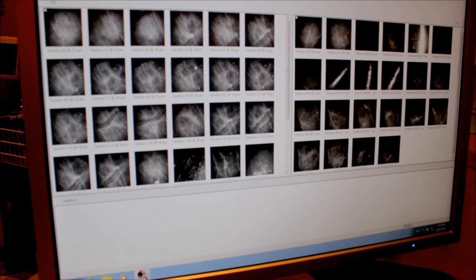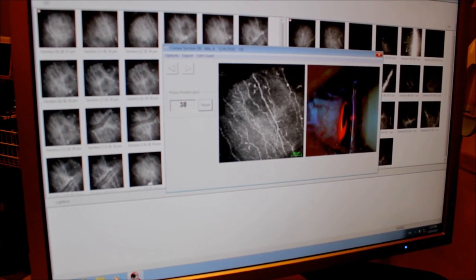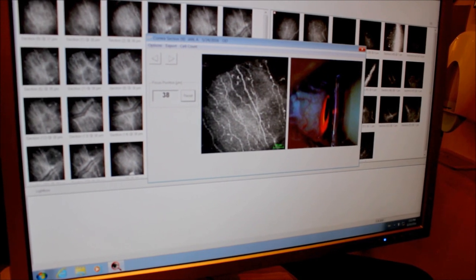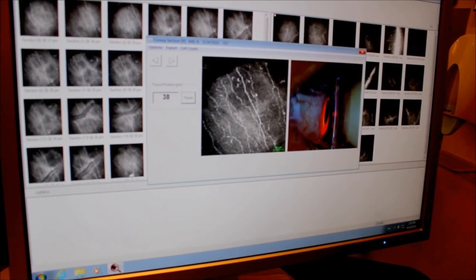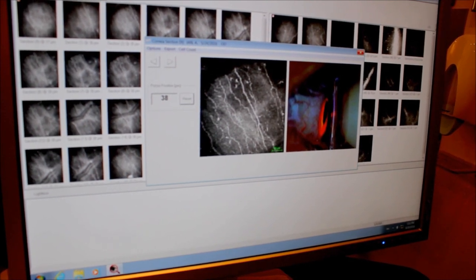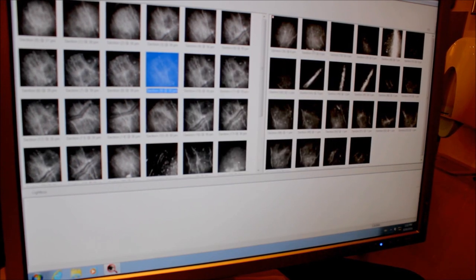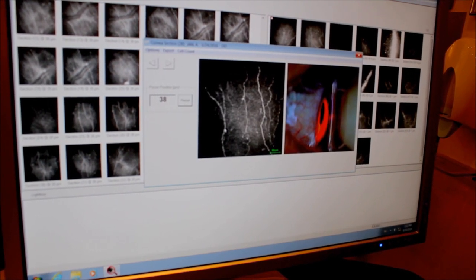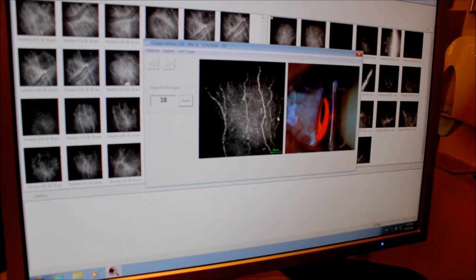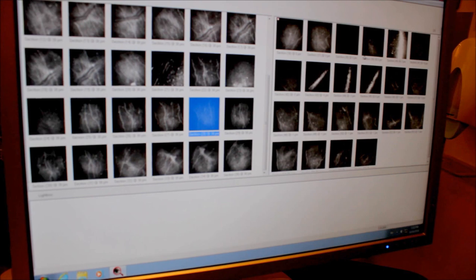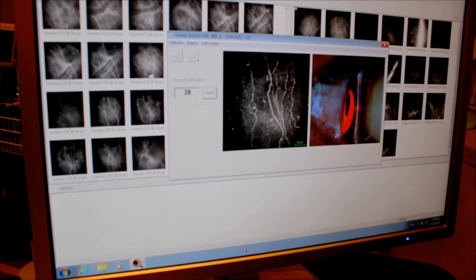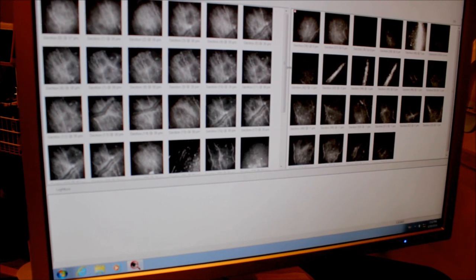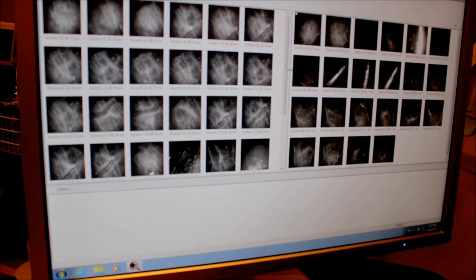So what you see here is images from different locations, but these images contain a comparable number of nerves. So the job is much easier in this case. You'll see here that this image contains about eight to nine nerves. If you browse through these images, you will find an image with a lower density, like this one, which is between five and six nerves. But that density doesn't go very low. So what we do in this case, we use the same approach, but you will notice the variability is not as high as for the patient.